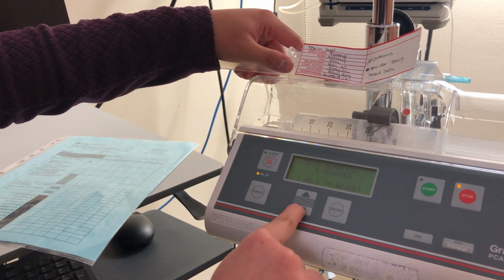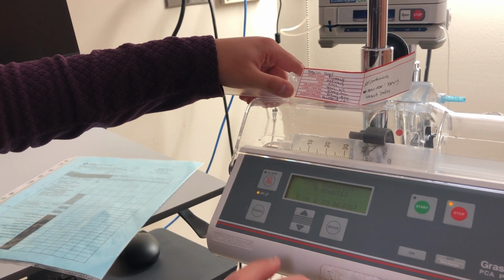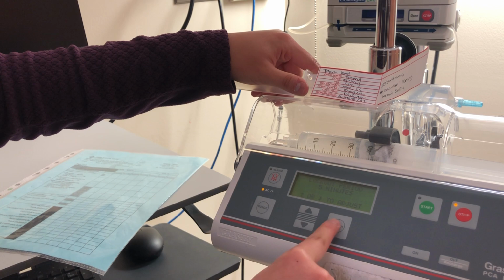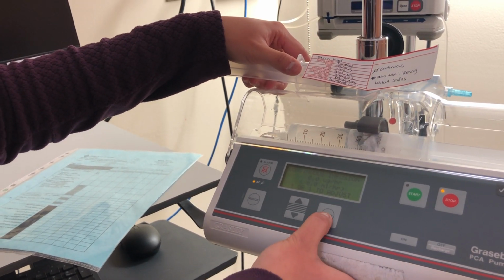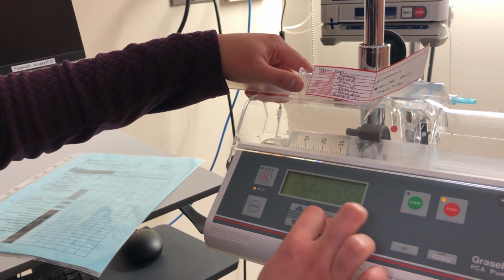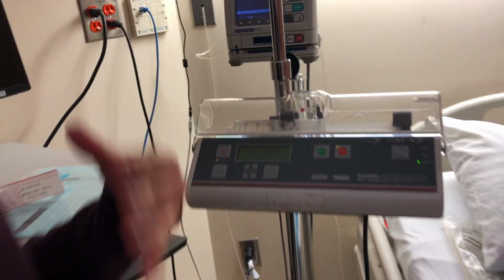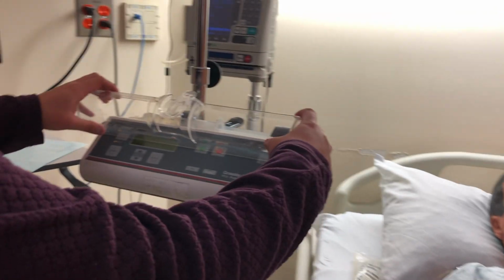And dose duration is 5 minutes, or which is our lockout. Oh, sorry, dose duration is 2 minutes, not 5 minutes. It's 2 minutes. Okay, enter. Lockout period, which is the 5 minutes. So enter. Continuous infusion, no, not continuous as per my label, so 0. And then the demands and goods, I'm going to document that as well and monitor every hour. And then end. And then I'm going to ask my second nurse to do their independent check. Okay, they gave me an approval sign. I have the correct information, so now I'm ready to change the syringe in the pump.